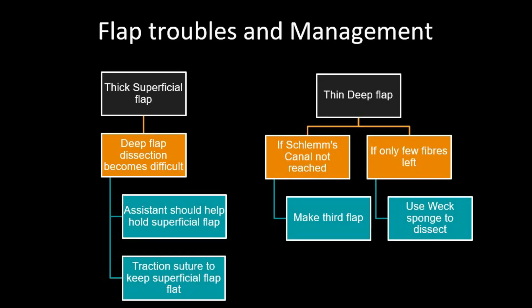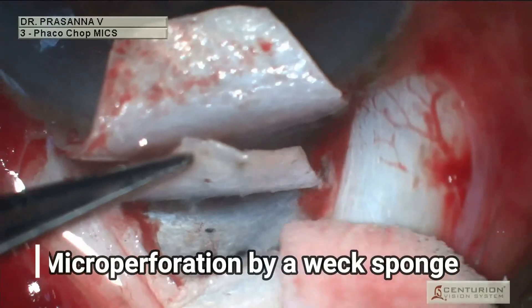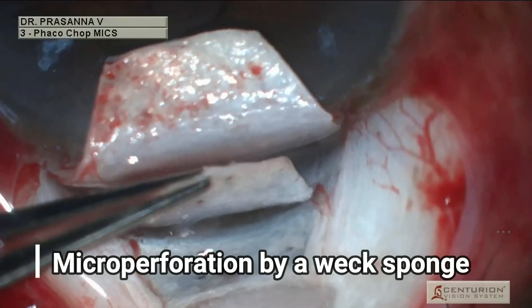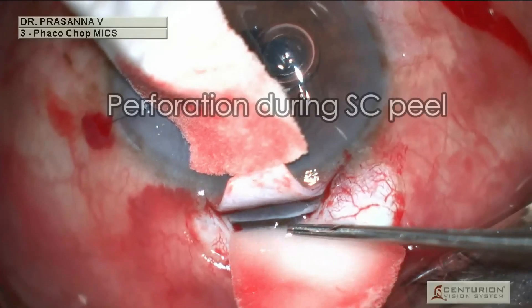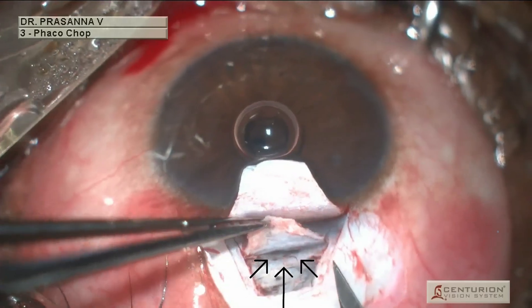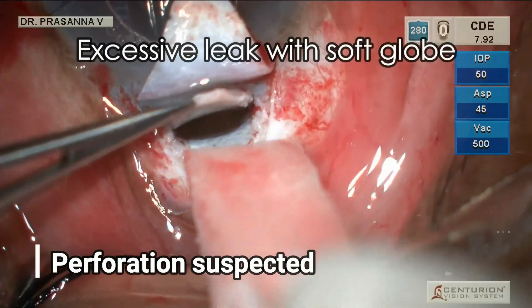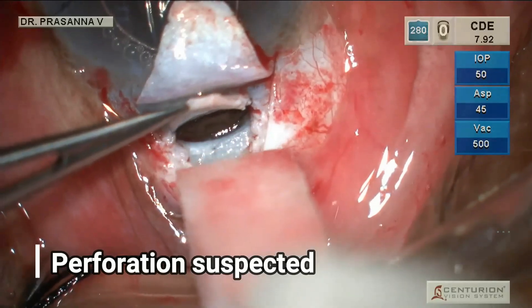This slide summarizes the common flap complications and their management. The next complication is micro-perforation of the window. One has to take extreme care, as this can happen at different steps. Micro-perforation does not portend bad prognosis — if managed appropriately, good outcomes are achievable. A suspected perforation is seen here, and the shallowing of the anterior chamber confirms it.